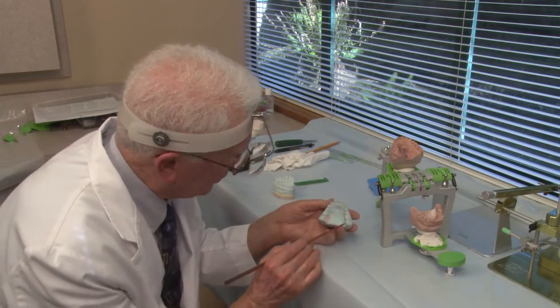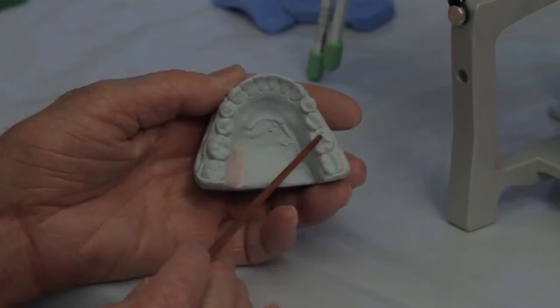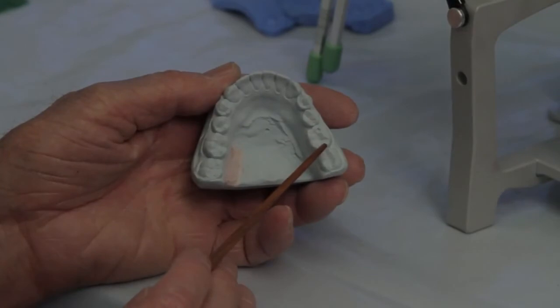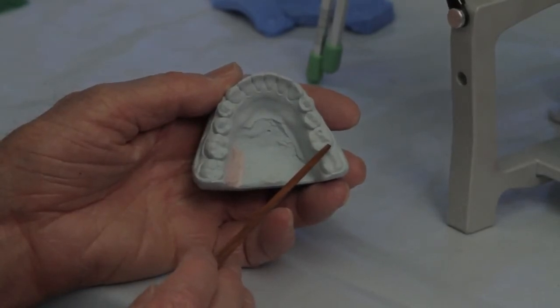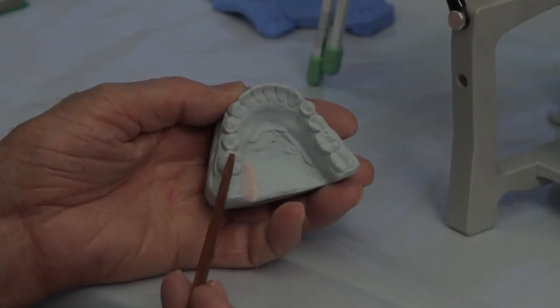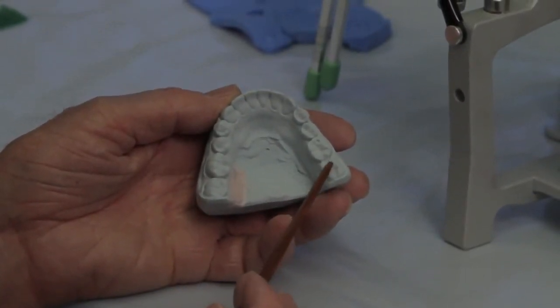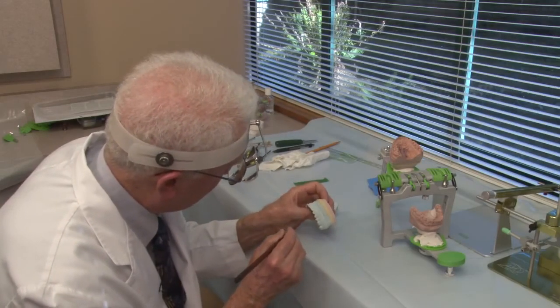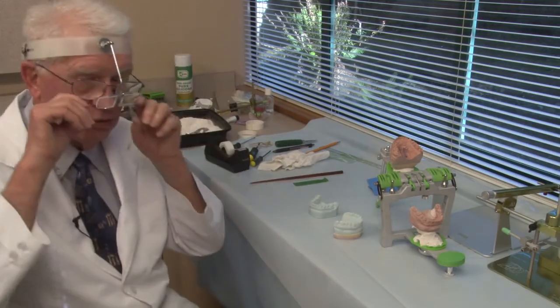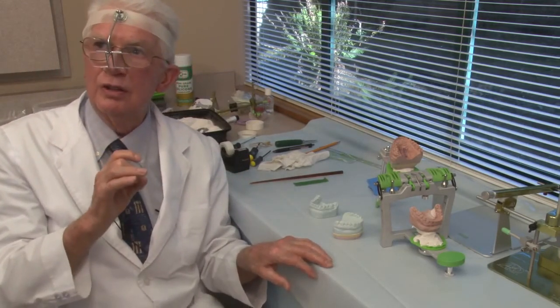Look at the lower teeth. Look, she's actually worn a hole. Look at that hole there in that cusp. She's worn the cusp down and worn a hole in it. It's the same way here. This cusp is practically gone. There are wear facets on all these cusps over here. Wear facets here. So very clearly, she, as a young lady, I'm going to guess 23, 24 years old, look how much she's already worn her teeth.